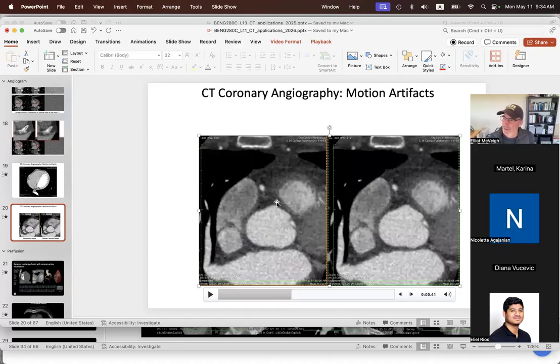Practically speaking, nowadays many of the radiologists who read these scans ask for us to reconstruct motion corrected images at many time frames across the heart cycle, so that they are darn sure that they're not going to have a CT exam in which they've wasted the patient's time in going and getting the exam because we have too much motion artifact. They always make sure that there's a clear picture by doing the motion correction and also reconstructing at different times across the heart cycle.